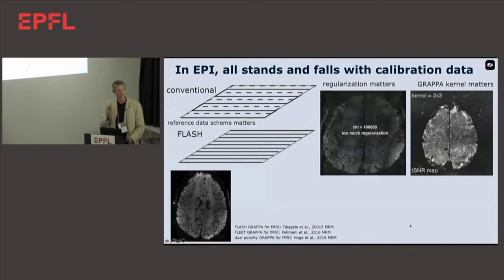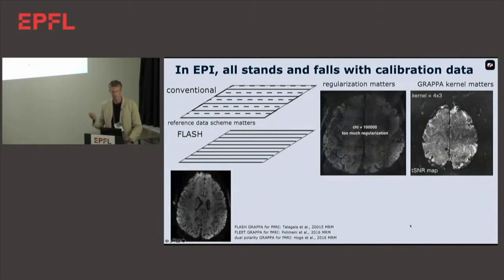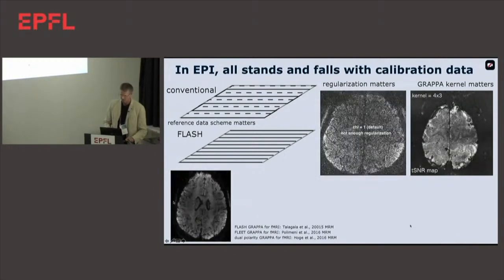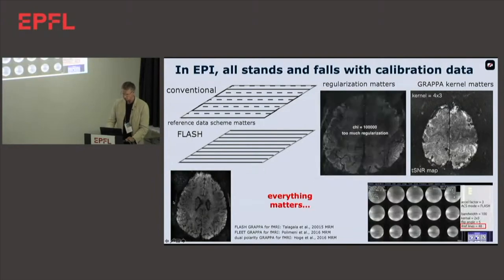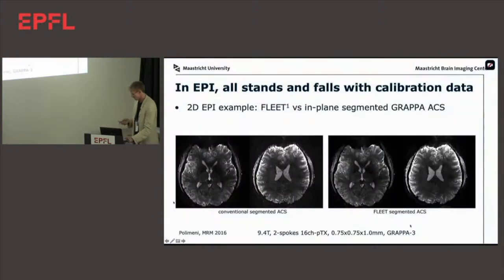There is a nice blog post by Renzo Huber on his website that tries to get to the bottom of this. If you're on a Siemens machine and do that kind of EPI reconstruction, I really encourage you to check it out as well. So everything kind of matters, and that's just how it is. It's worth getting things to work nicely if you do EPI. Even if you don't understand what you're doing, it's worth the effort to set up something that works and then not touch it. Sorry, it sounds really dumb, but that's how it is.